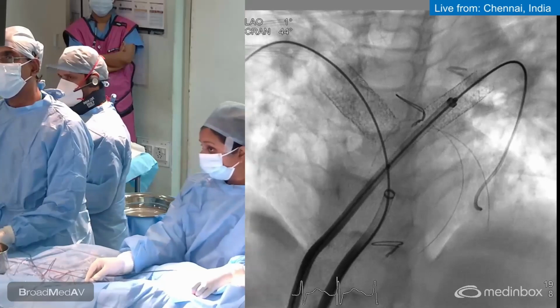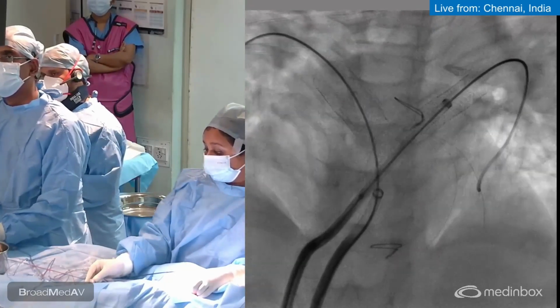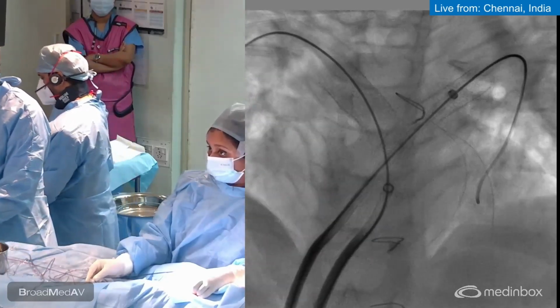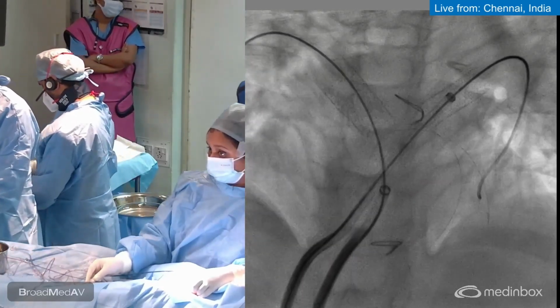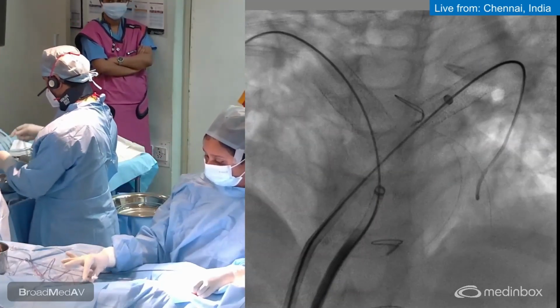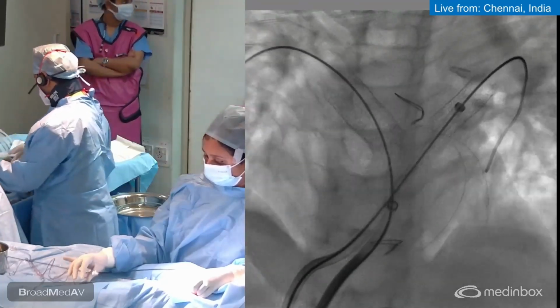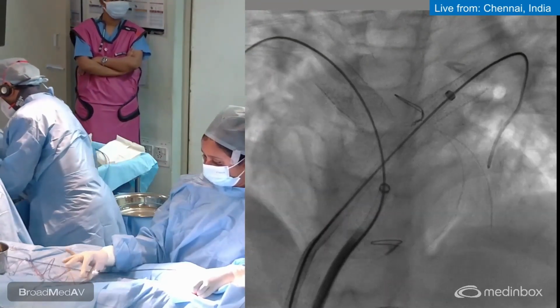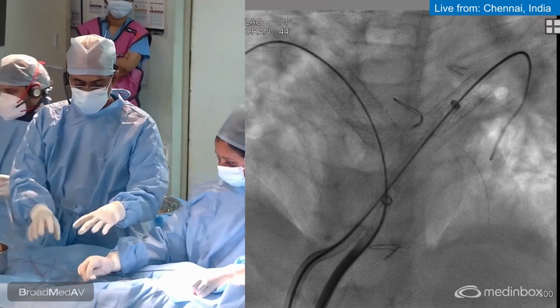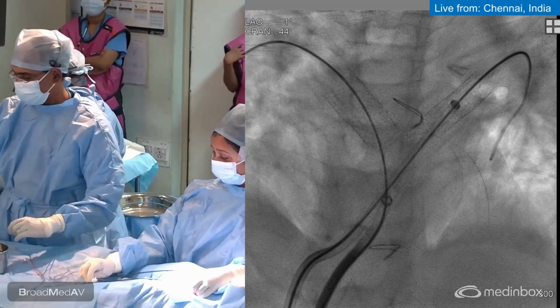This is fully negative? Okay. Out. Hold everything intact.